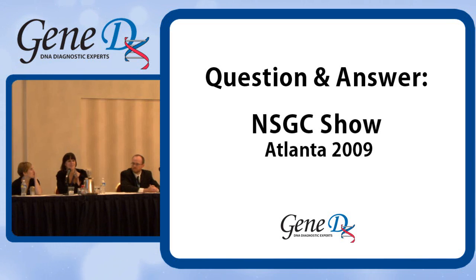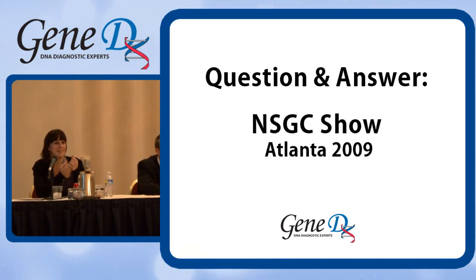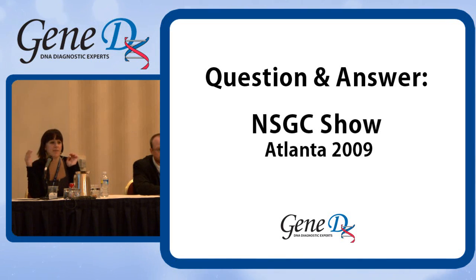I'm not here to stand on a podium and say which is better, but for the application that is obvious, it's for UPD. Obviously I think it's going to pick up in general microdeletion duplications. I realize that, but there are some things that it may not pick up that you're going to pick up somewhere else on a whole genome scan with a smaller probe spacing and a different backbone.